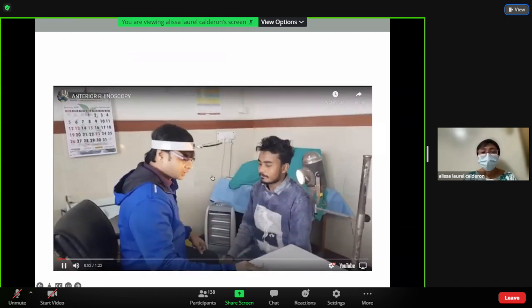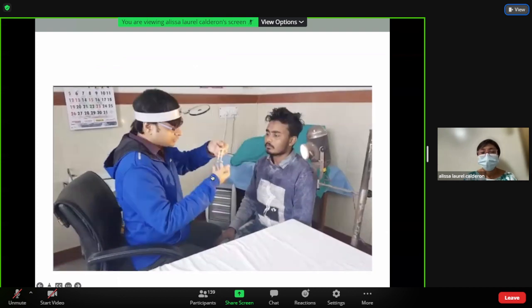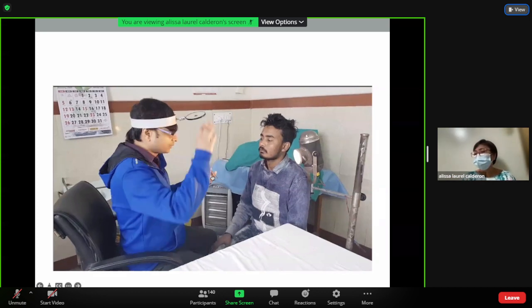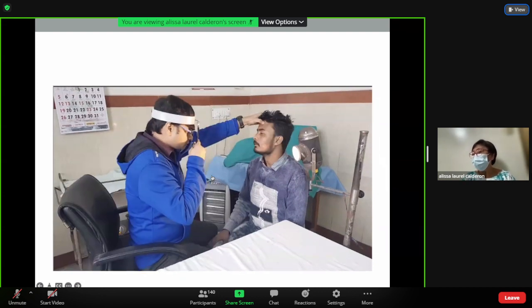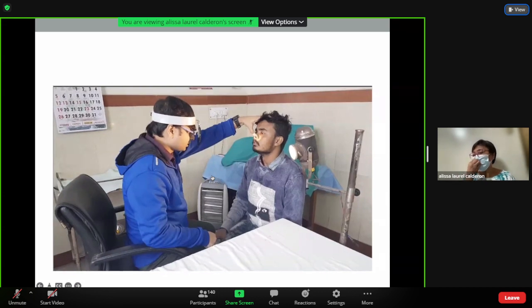In anterior rhinoscopy, we use the Thudichum nasal speculum. The nasal speculum is held in position like this with the index finger. We can support with the ring finger and the middle finger and introduce it in the nasal cavity and examine the nasal cavity. First of all, we check for any abnormality in the nasal cavity, like any mass or any growth in the nasal cavity. We look for any septal deviation in the nasal cavity and for any other abnormality.